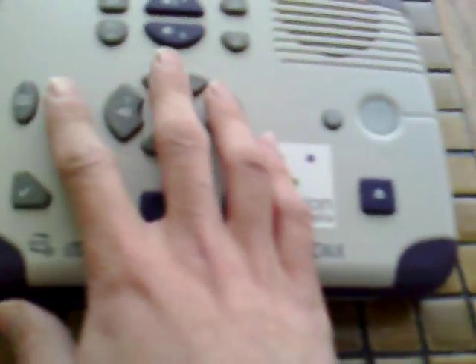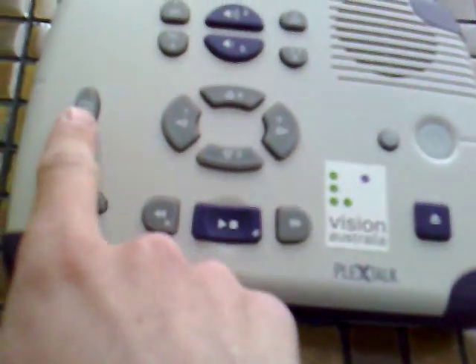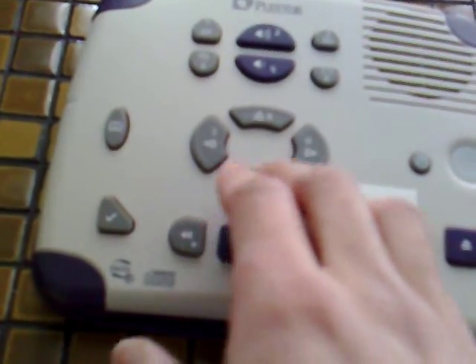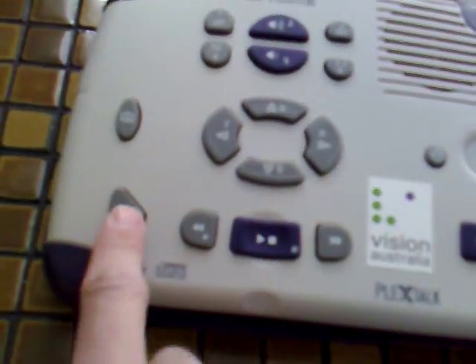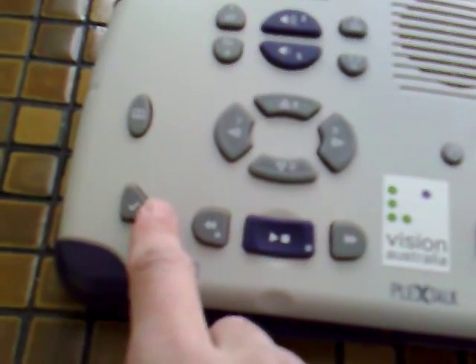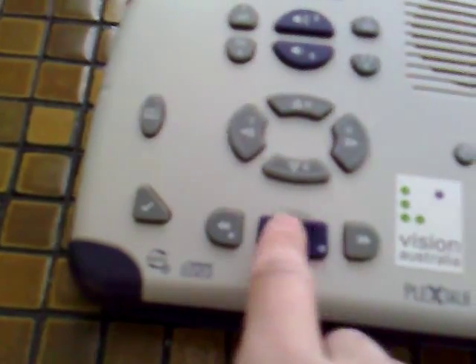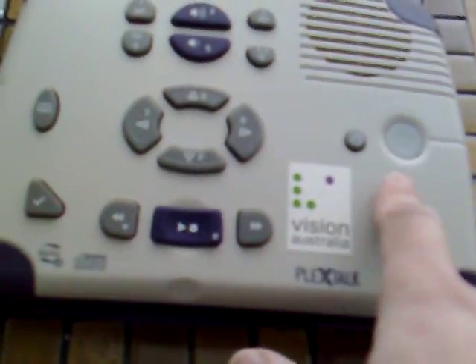Then you have a series of arrow keys which allow you to select the element you want to move by, and then move by the selected element, and I'll show you that very shortly. We have the Go to Page button, which you can press and then enter the page number you want to go to. You've got the Bookmark button, which allows you to set bookmarks and then go to them. You've got your standard Rewind, Fast Forward and Play buttons down the bottom, then the Eject button for the CD, the Power On button, and the Sleep Timer button.